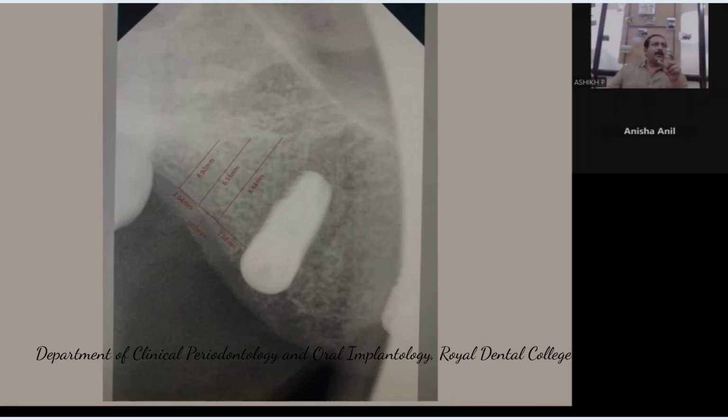Now imagine what is going to happen with the nearby implant area. It can crack. So going beyond it is a definite issue here. Now we've got to place a 3.75 diameter implant. So there is always a chance that when you place an implant, the bone can break and it can cause problems to the nearby implant as well. So you've gone double the size of it. Now here comes the clinician's decision of what to do further.